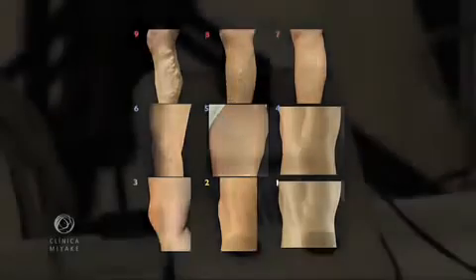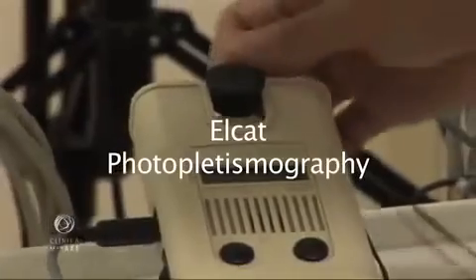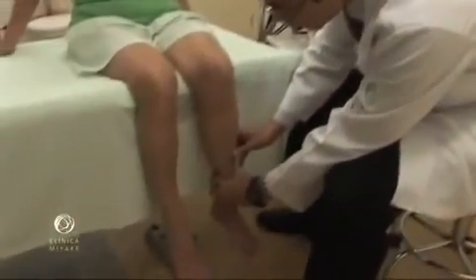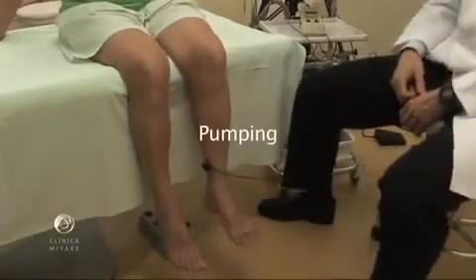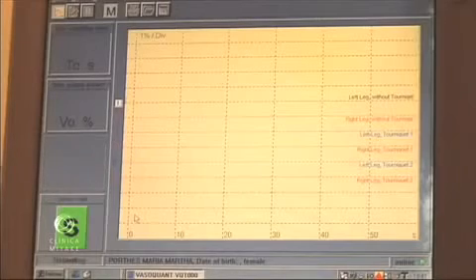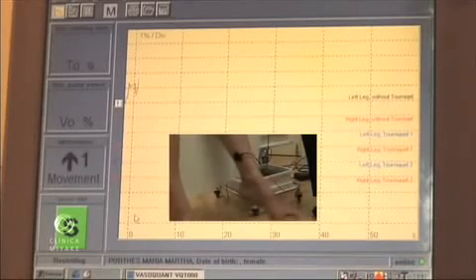The 9 to 1 score translates a treatment-oriented table. It helps to avoid misdiagnosis and, consequently, treatment failure. Photoplethysmography subsequent to ultrasound evaluate the functional state caused by the reflux. Both help placing patients on the first and second line.